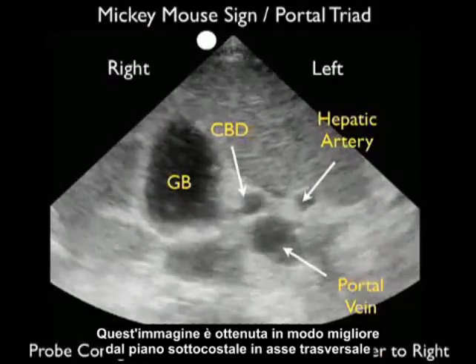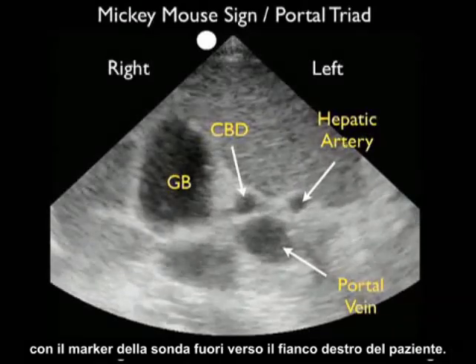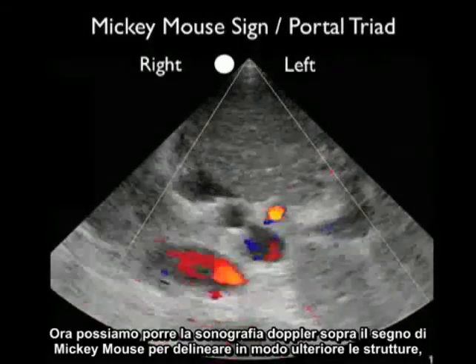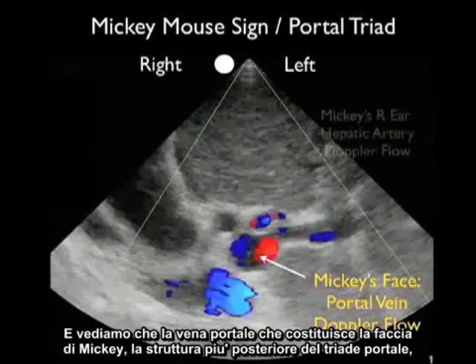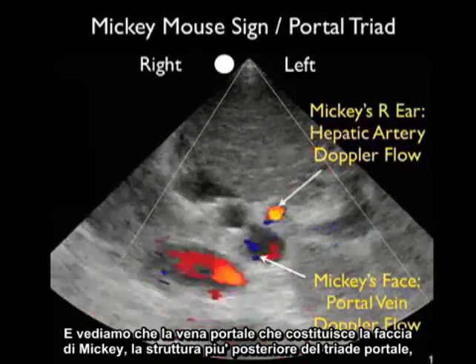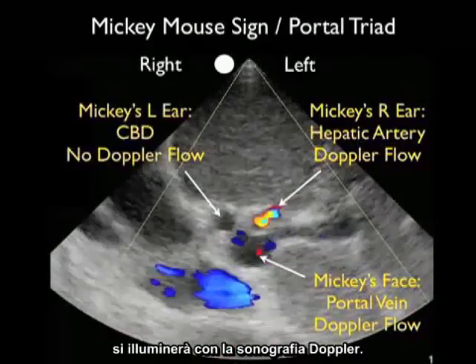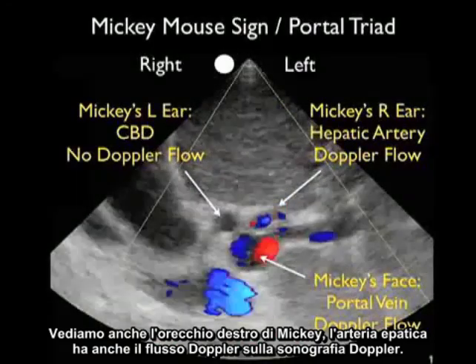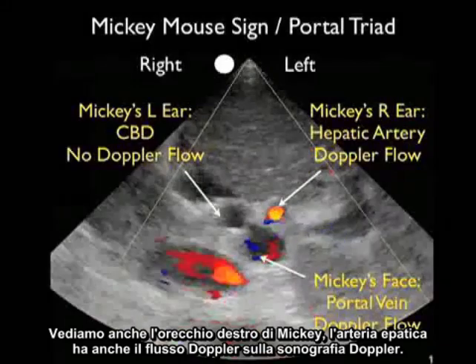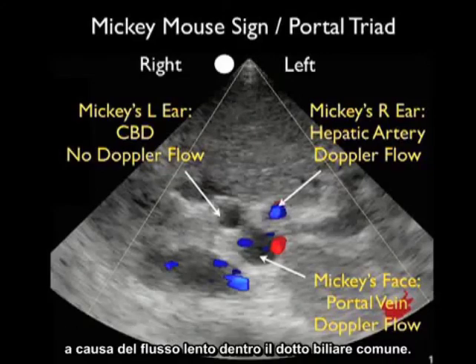This image is best obtained from a subcostal plane in a transverse axis with the probe marker towards the patient's right side. We can place Doppler sonography onto the Mickey Mouse sign to further delineate the structures. The portal vein — Mickey's face, the posterior-most structure of the portal triad — lights up with Doppler sonography. Mickey's right ear, the hepatic artery, also shows Doppler flow. However, the common bile duct — Mickey's left ear — fails to show any Doppler flow due to the sluggish flow within the common bile duct.